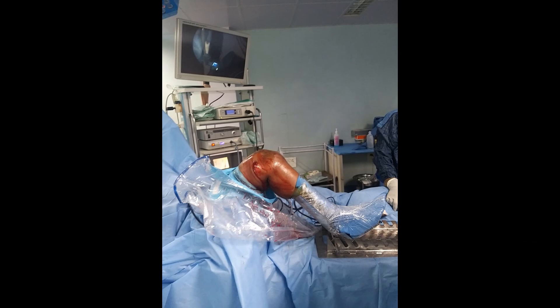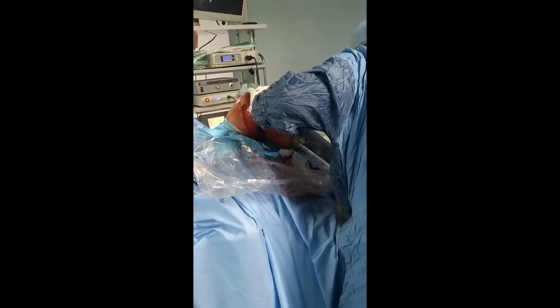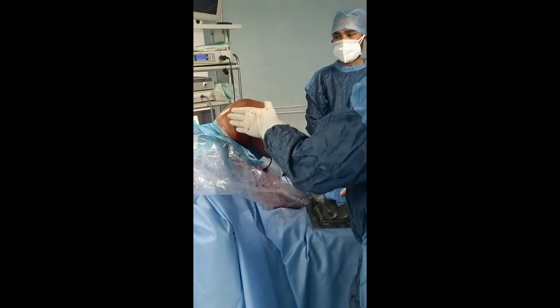There is usually a collection of around 150 to 200 ml of blood in these patients. This was the post-op movement — 120 degrees — which we were able to achieve at the end of the procedure. In the post-surgical video clip, we were able to achieve a 120 degree range of motion in this particular patient.